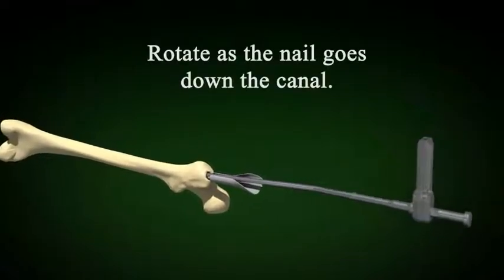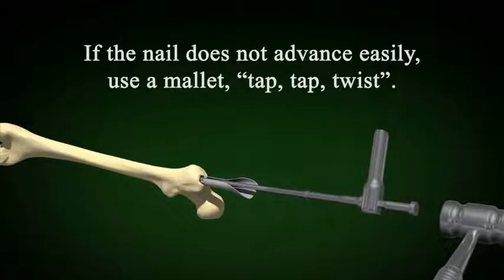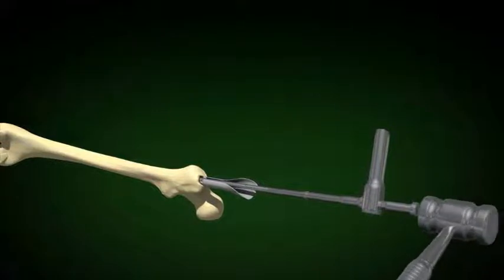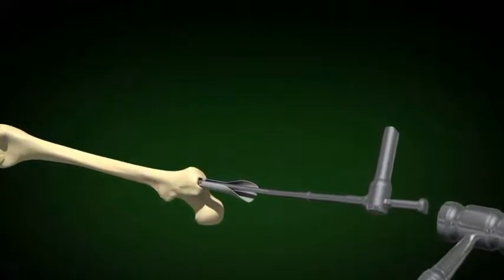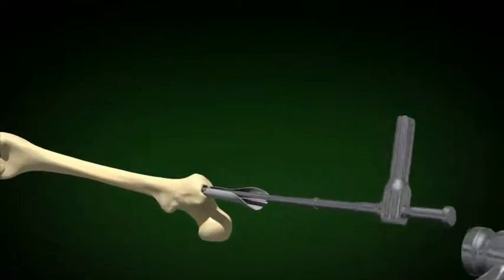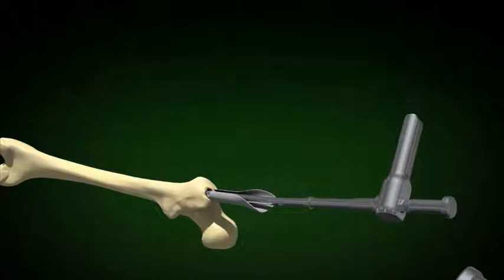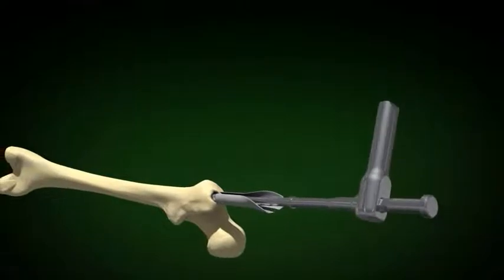The 1.5 degree bend is crucial, and as you rotate the nail, it will create a larger tract. If the nail does not go in easily, tap it lightly with a mallet and then rotate after every 2 taps. If the nail becomes stuck, remove the nail and ream larger.